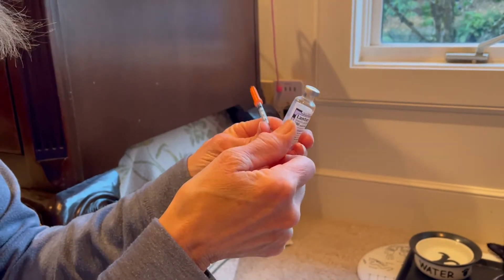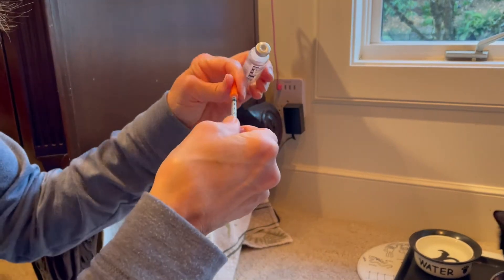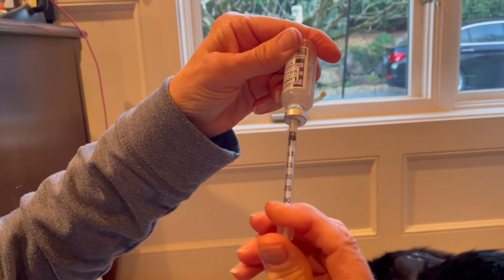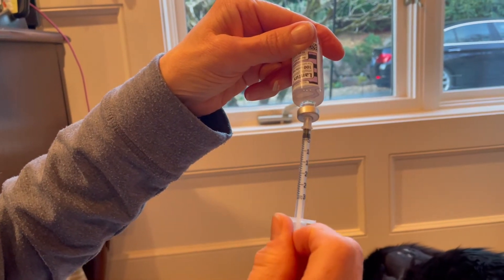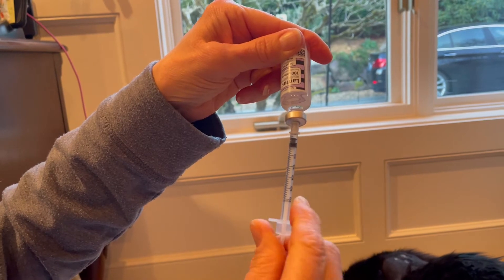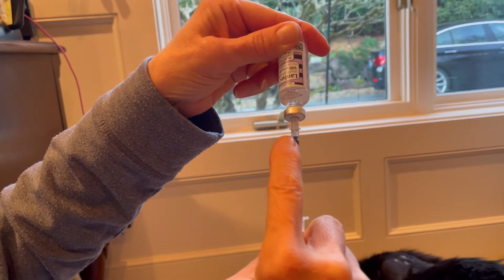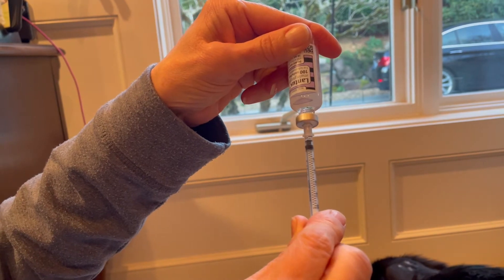We take off the cap on the back and the cap on the front, push all the air out, and then draw up. You can see — one, half, one — so one and a half units is going to be right there.